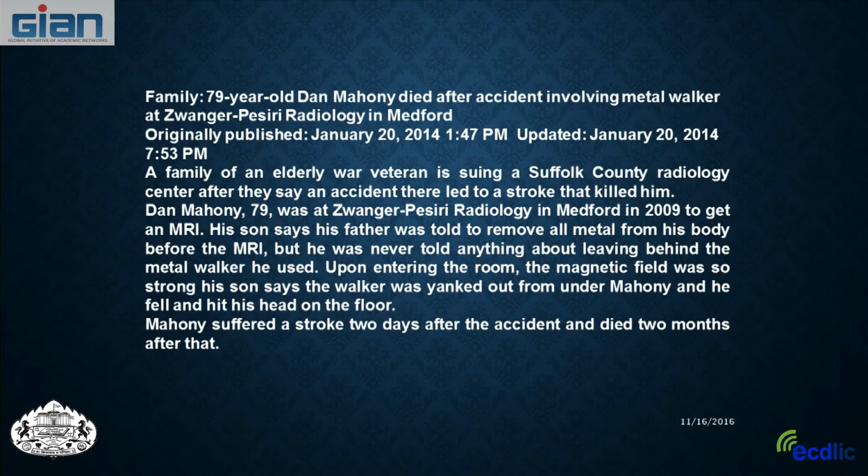So this is a case where he was screened very well and checked for no metal in his body, but then nobody thought about the metal walker that he was using. And of course, having it ripped so violently out of his hands can lead to accidents of other sorts.